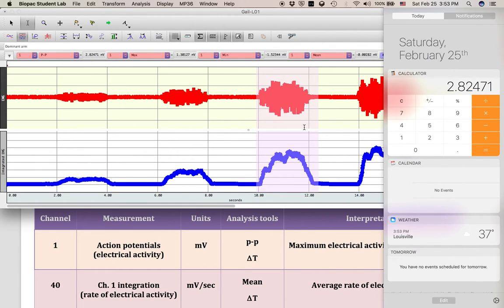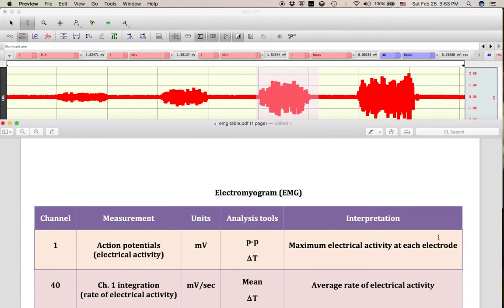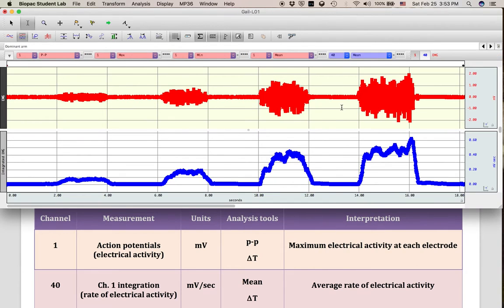What this tells us is the highest electrical activity found at each electrode, E1 and E2.